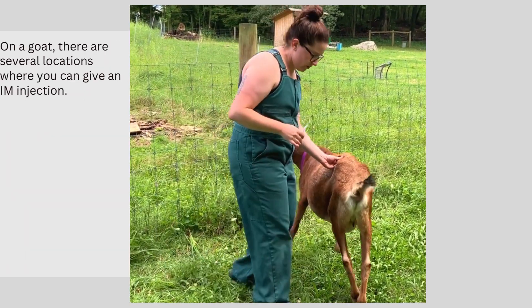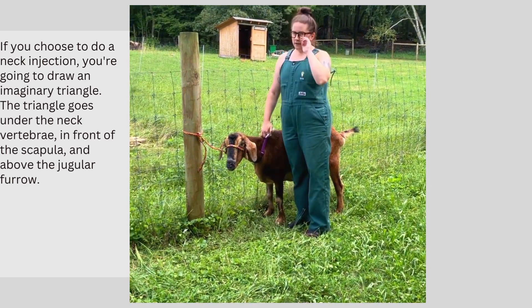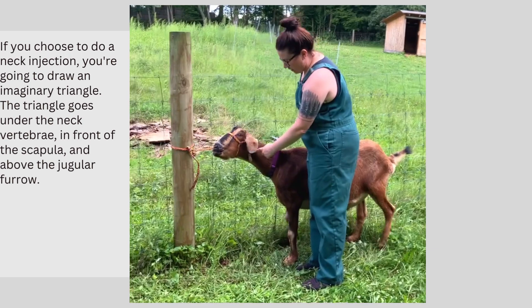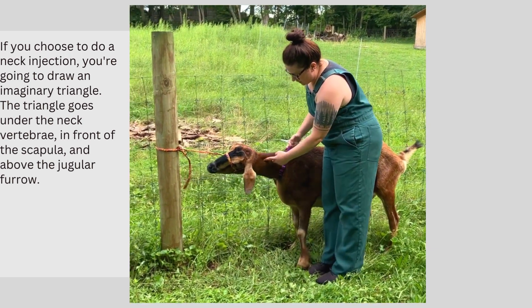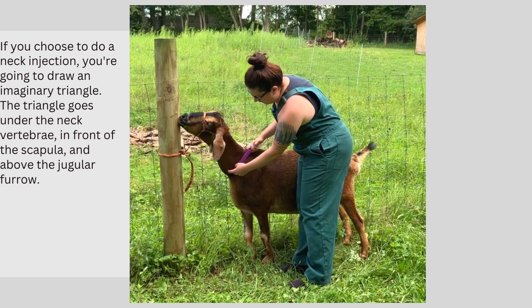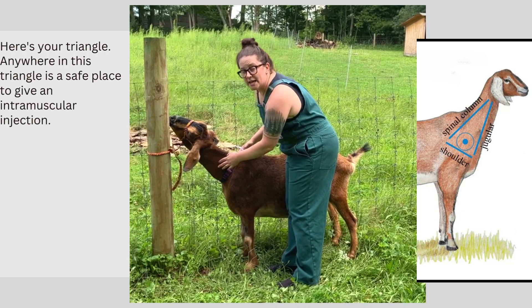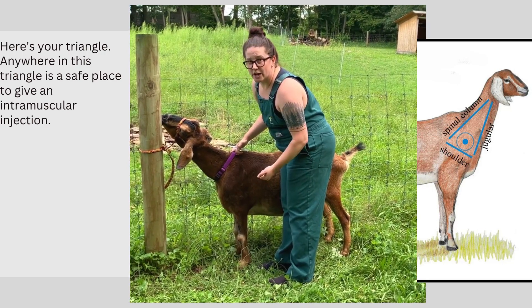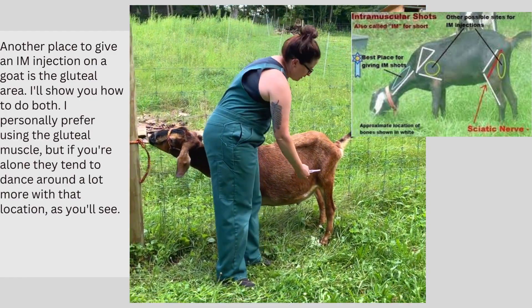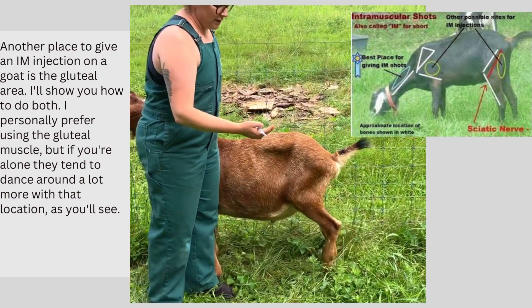Now on a goat, there are several locations where you can give this. If you choose to do a neck injection, you're going to draw an imaginary triangle that goes under the neck vertebrae, in front of the scapula, and above the jugular vein. Anywhere in there is a safe place to give an intramuscular injection. Another place you can give an intramuscular injection on a goat is the gluteal muscle back here. I'm going to show you how to do both.